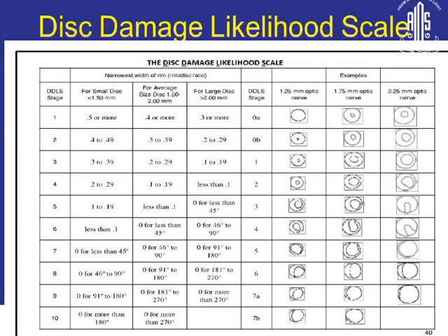And then you have to look at the neural rim. So if you have a disc which is less than 1.5 millimeters, you have to look at the thinnest portion of the neural rim. If the thinnest portion of the neural rim in a small disc is 0.5, then you are going to grade it. These are the grades. They are graded from 0 to 7, and in 0 you have A and B, and 7 also you have A and B.